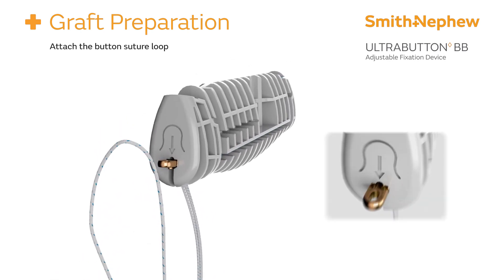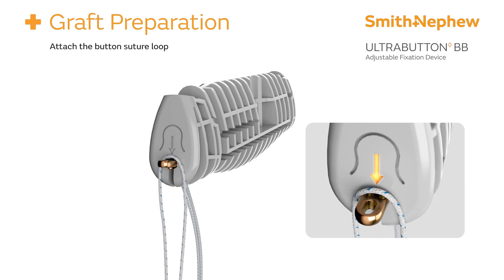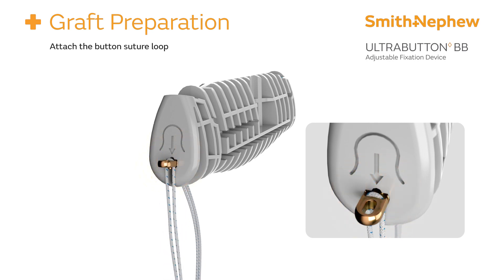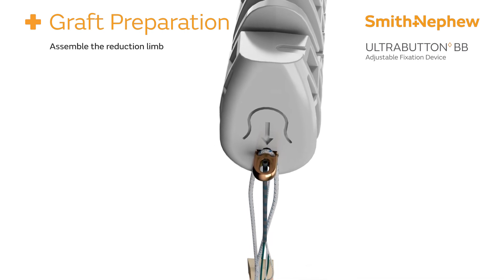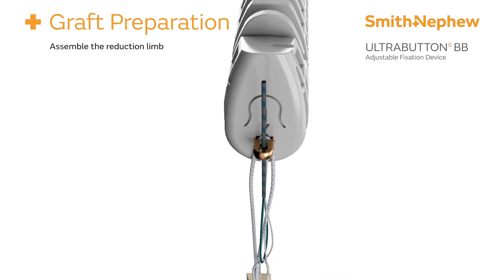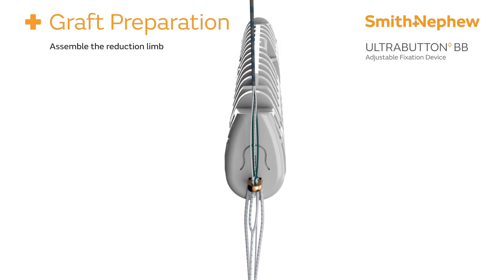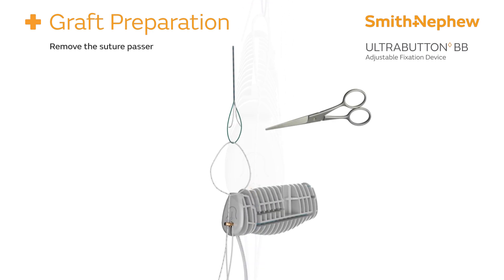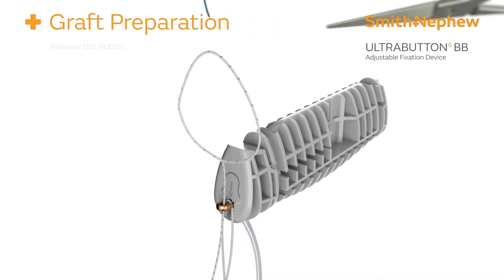Find the exposed button on the reduction bar and snap the loop into the open slots of the button, following the direction of the arrow on the bar. Ensure both sides of the loop are fully snapped in before proceeding. Assemble the reduction limb by feeding the suture passer through the remaining hole opposing the direction of the arrow. The suture passer can then be removed by cutting the solid green suture.